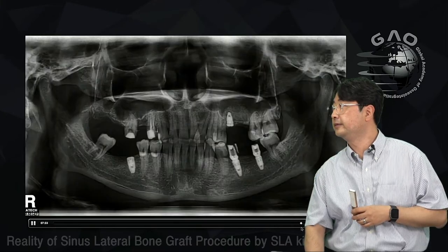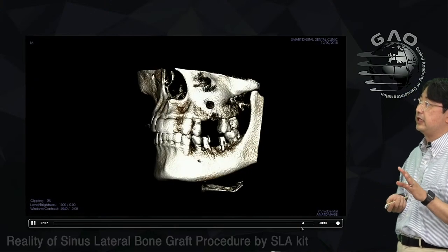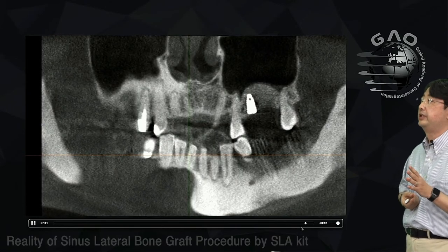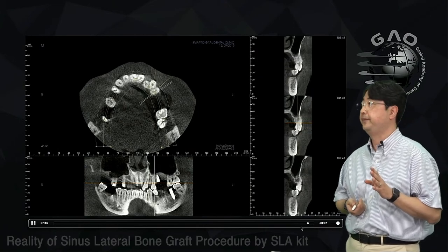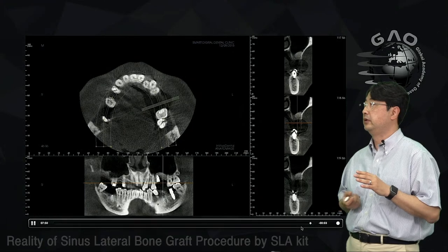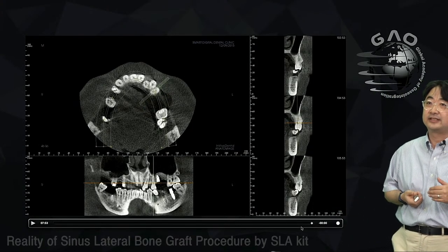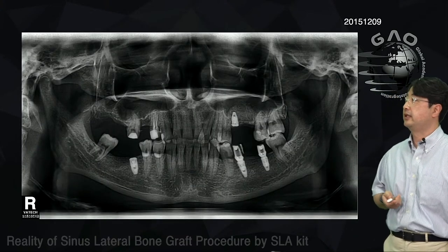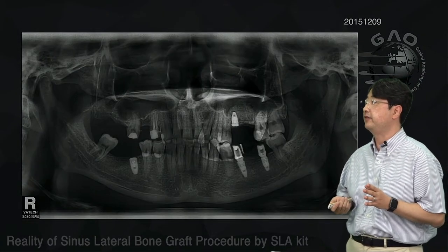Like this. So this is immediately after the sinus graft, and you see the window opening on the anterior lateral wall. And this is a CT cut of the surgery. You see the bone fill around the implant. I decided not to place implant number 26; I'm going to place it later on. So this is immediately after the sinus graft and implant placement on number 25, right?